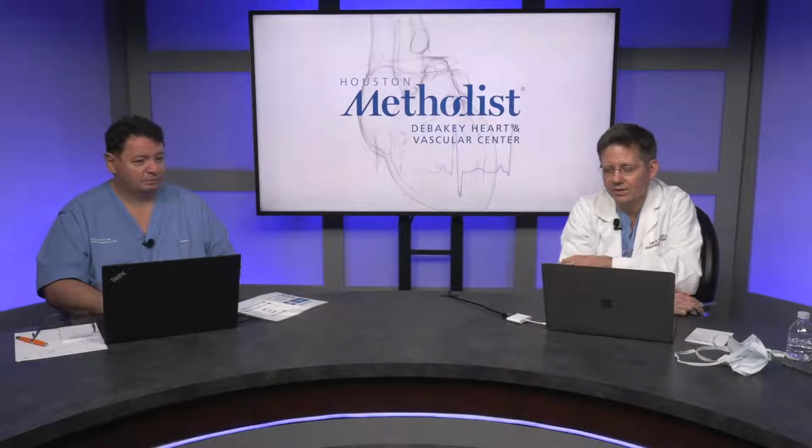Great. Well, thank you very much, Zsolt. Zsolt and I have been partners for a long time, and I think it's really important to collaborate with other people, particularly when taking care of these really sickly people. So I think that correlation between the ultrasound studies and what happens clinically and what happens for other procedures are really important to take into consideration. So it's really important to have feedback to the vascular lab and the people doing the ultrasound studies to go over abnormal findings and not just discount them as misses. And that's the only way we learn and progress.